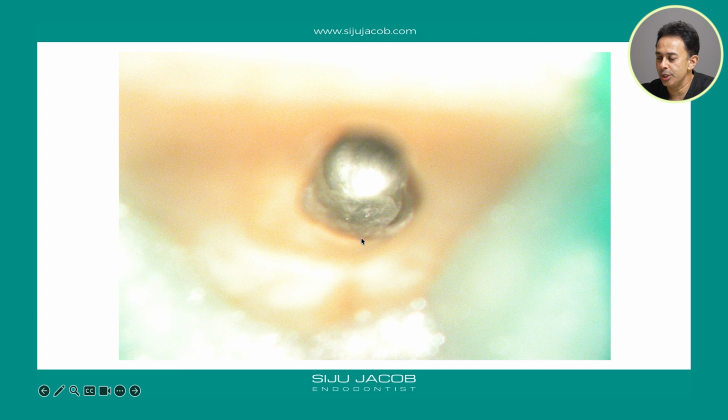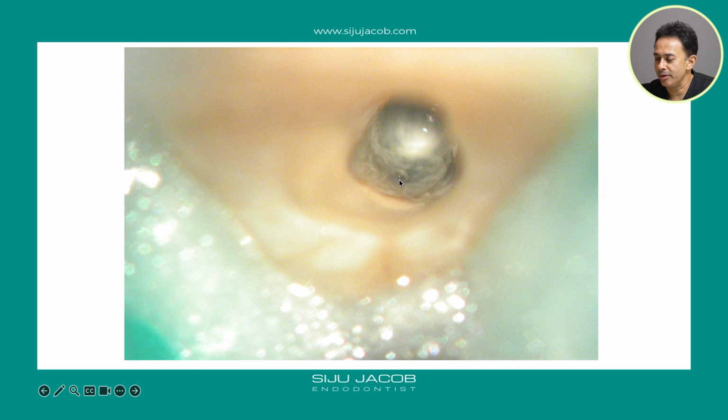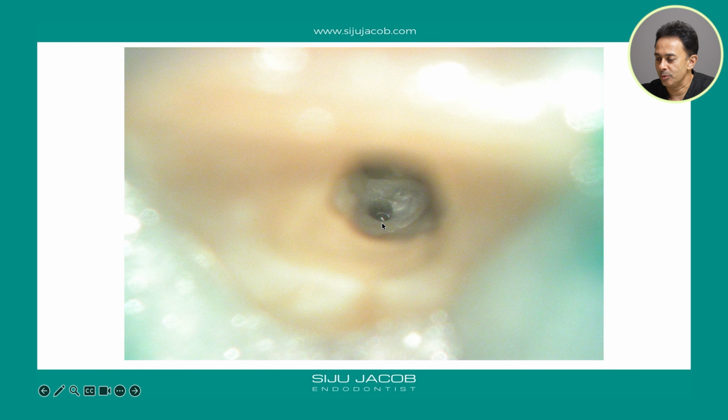This whole thing used to be, once upon a time, the entire root canal, which is now calcified. Once we know that, we can drill down this calcified portion of the canal, and sure enough, that's where the root canal is. You can see that's the root canal opening in the middle of the tooth, and this part shows you what used to be the entire pulp or the root canal at one point in time, filled with pulp, and now it's calcified, but we found the opening in the middle of that calcified part.